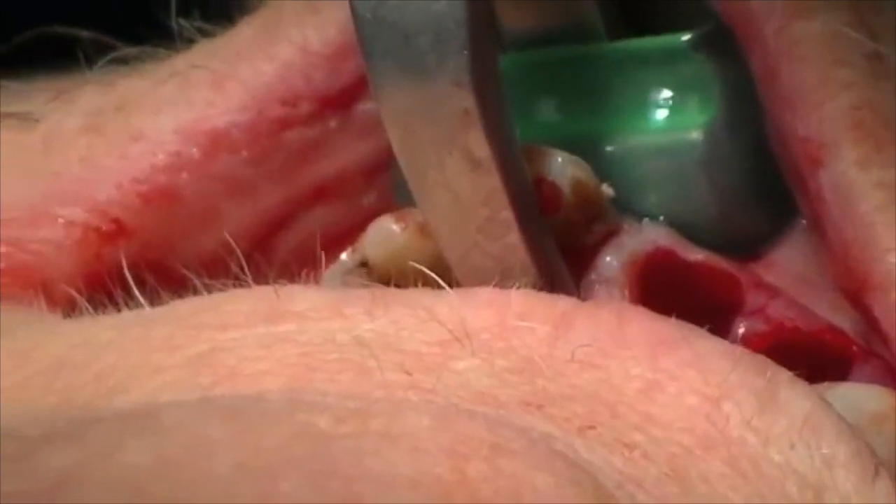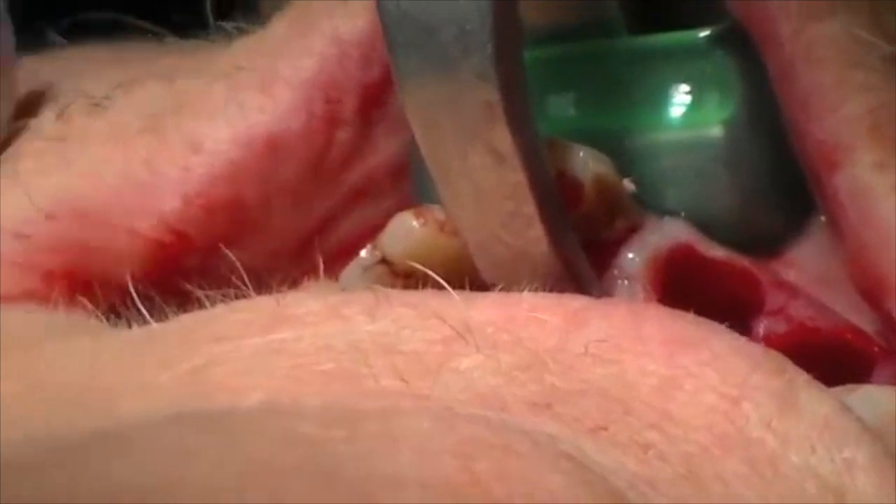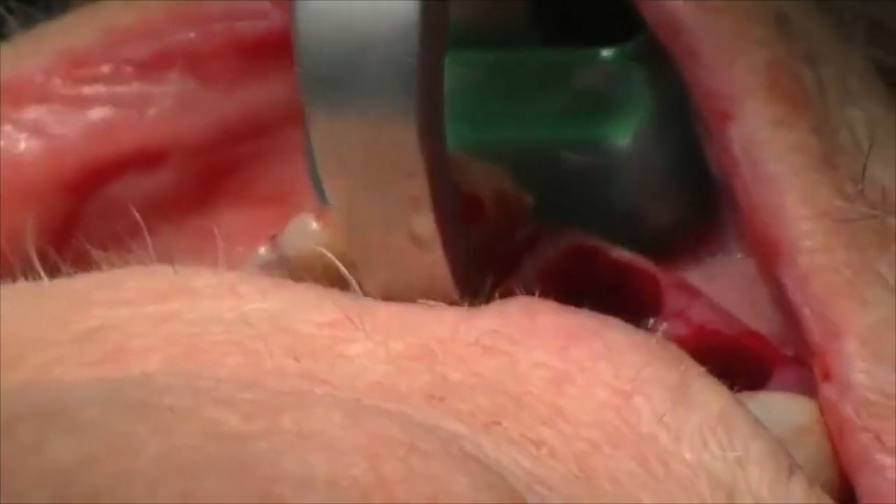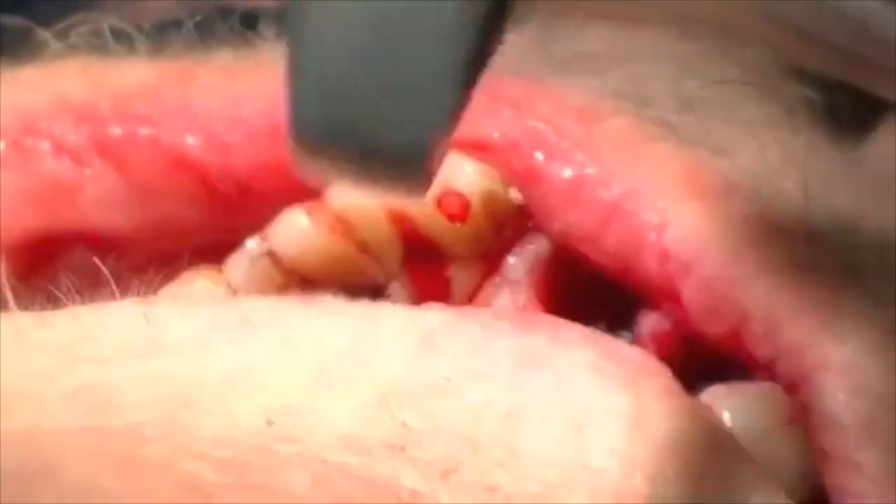I can feel it pop. We've moved the tooth two, three millimeters out of the socket.